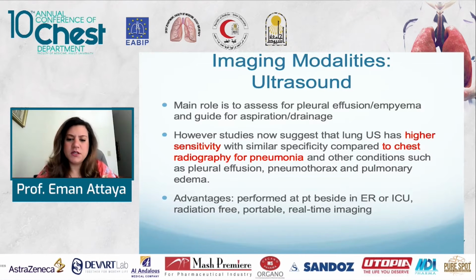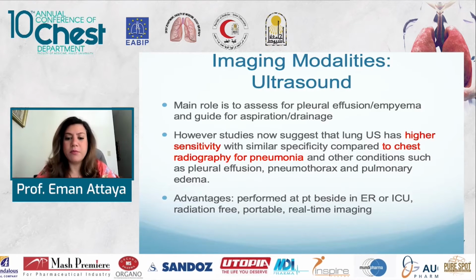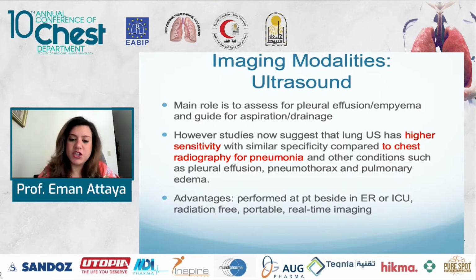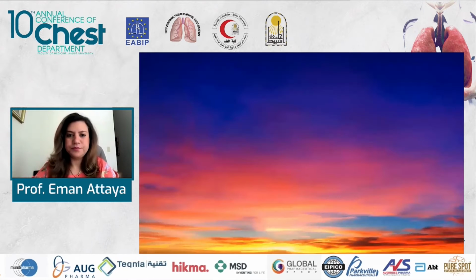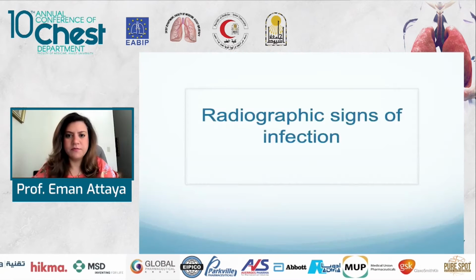Its advantages are that it can be performed at bedside in the ER and ICU. It's radiation free, it's portable, and it's real-time imaging, so you get to see everything in real time. I just added some photos that I've taken to add some color to the presentation.